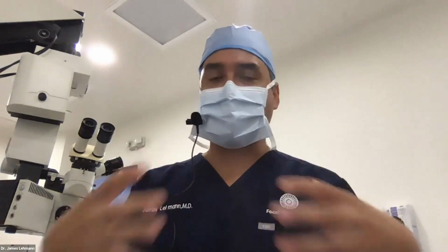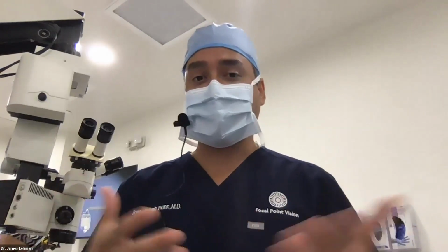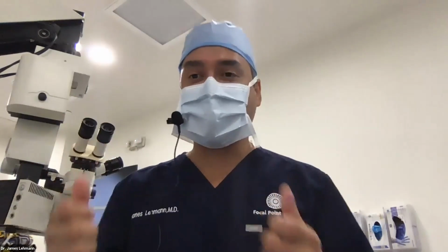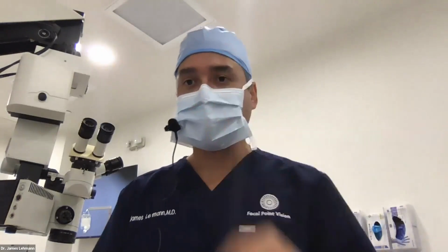Yeah, I'm ready for the lecture, and I'll answer a few questions that have come up on the chat. Dr. Rajesh Agarwal asked, do I regularly prefer dispersive viscoelastic? In all our cases, we use two viscoelastics: the dispersive for the first part, doing the rhexis, and then when we're going to put the bag in, we use a cohesive. There's some combination ones that work great, and you just need one. If you only had one, you probably would want a cohesive because it's easier to remove. If you use a dispersive to fill the bag and then you put the lens in, it's very difficult to get all that dispersive out, and you can't be sure where the lens position is in the bag. So if you only had one, go with a cohesive. But if you could have 2, that's the best way.